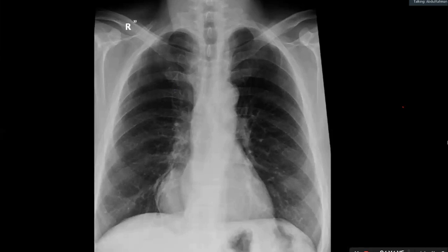Okay, excellent. So if it's a posterior mediastinal mass, what is your differential diagnosis? I know I'm talking to chest radiologists. What's your differential diagnosis there? Okay. I'm thinking of neurogenic tumors like schwannoma, neurofibroma, paragangliomas, any bronchogenic cyst or foregut duplication cyst, or it can be lymphadenopathy. Okay, all right, excellent.